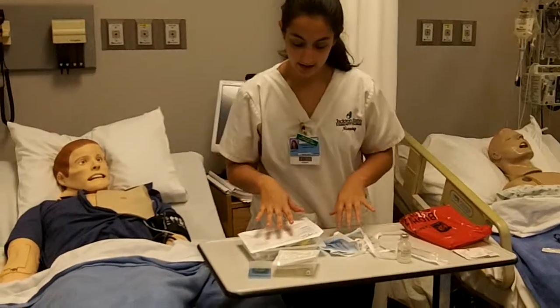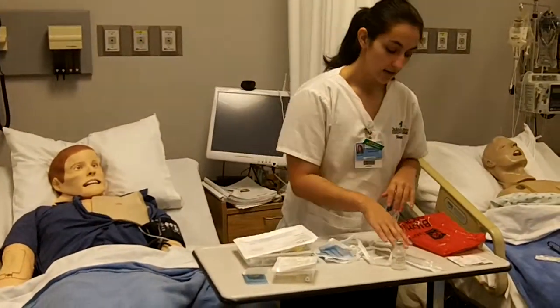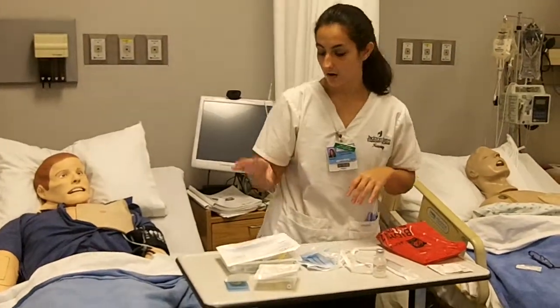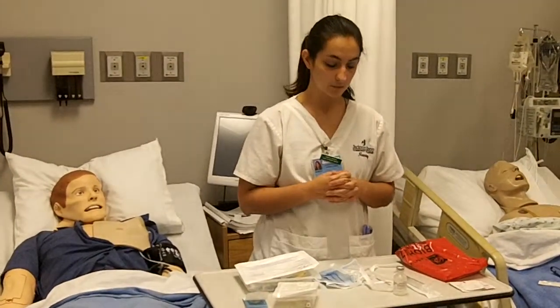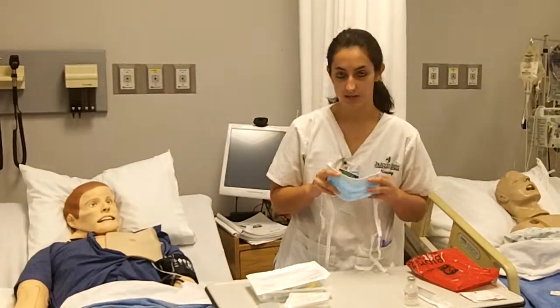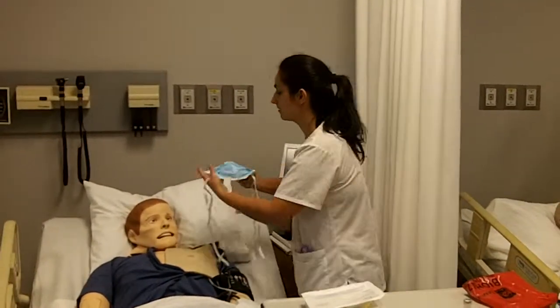Okay, and here I have my dressing change tray. I have a Huber needle, I have a bio patch, and I also have a 10 milliliter syringe, and also a 22 to 18 gauge needle. So first off, I would place a mask on my patient. I would tell him that this is a sterile procedure, and if he can tolerate it, go.